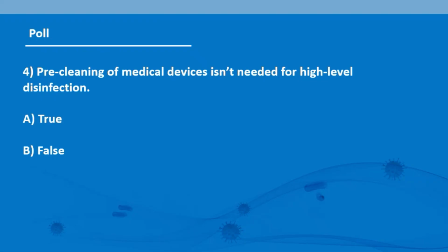Another poll question. Pre-cleaning of medical devices isn't needed for high-level disinfection. True or false? The correct answer is false, and I'll explain that in the next slide.